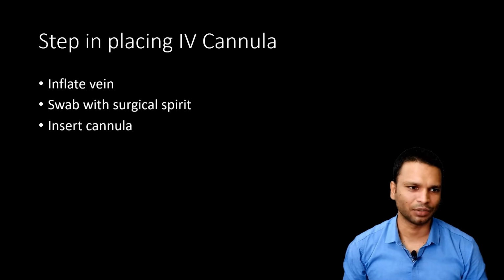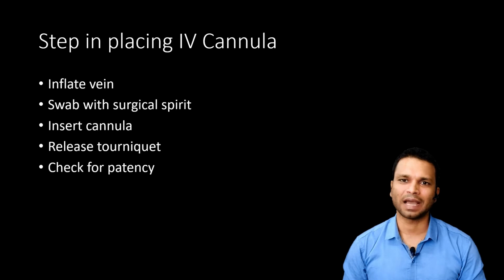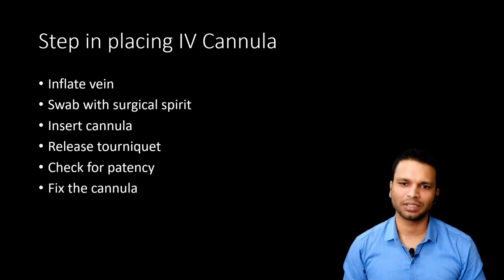Then we insert the cannula and then we release the tourniquet. We check for the patency of the placed IV cannula, whether it is inside the vein or not. Then we fix the cannula using the surgical tape or Dynaplast.